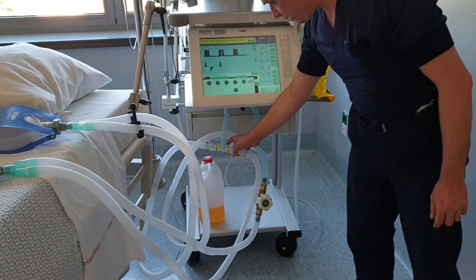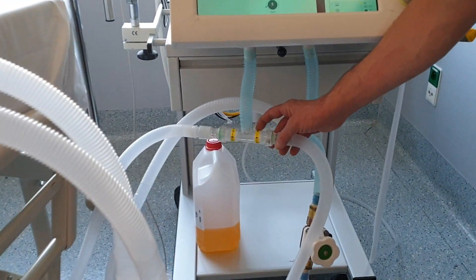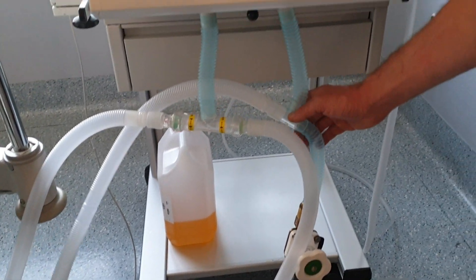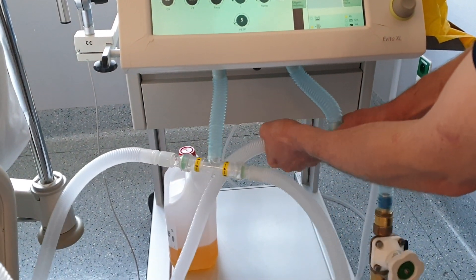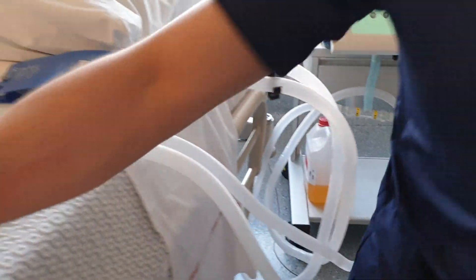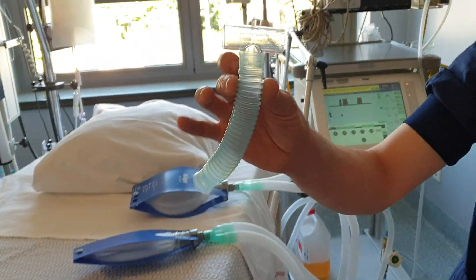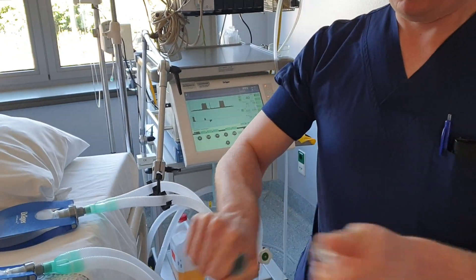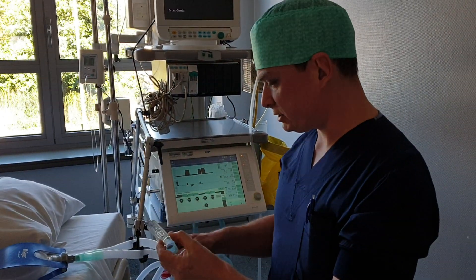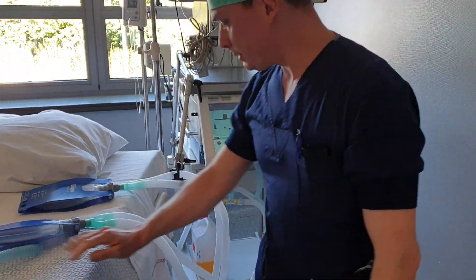Important: the one-way valves on the expiratory limb. Expiratory limb, inspiratory limb — standard T-connectors like this. I have one T-connector here, a simple T-connector, and it's all you need: some tubing, T-connectors, and the above.